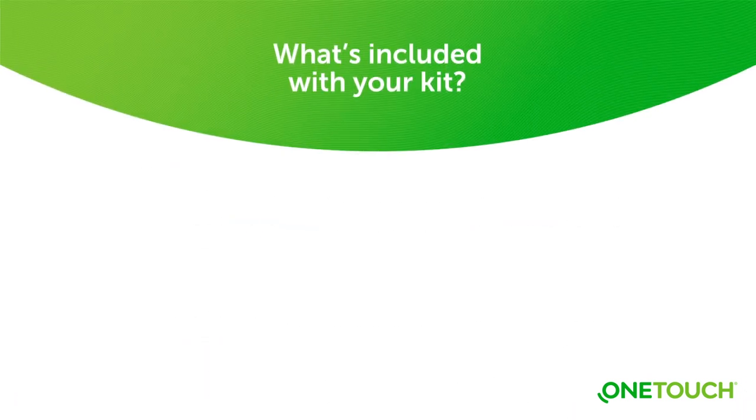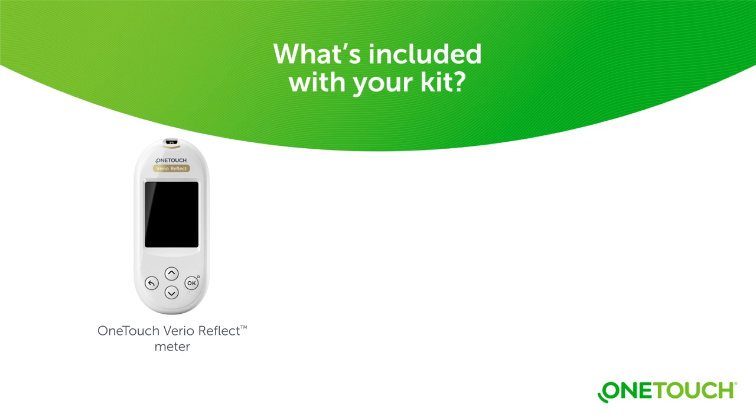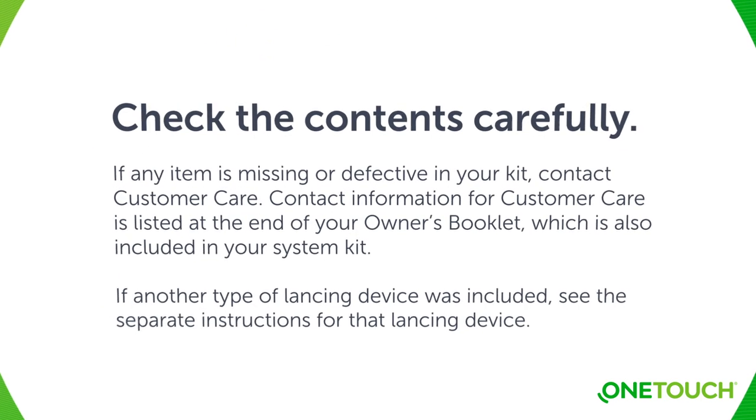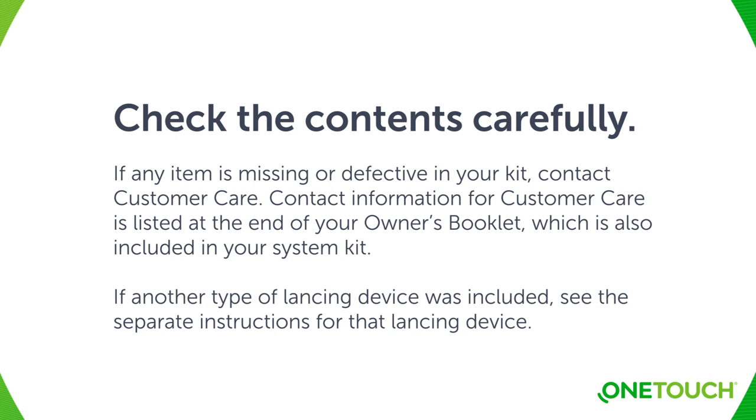In your OneTouch VarioReflect system kit, there is the meter itself, the OneTouch Delica Plus lancing device, and a pack of OneTouch Delica Plus lancets. The OneTouch VarioReflect meter uses OneTouch Vario test strips, which can be purchased separately. Check the contents carefully. If any item is missing or defective in your kit, contact customer care. Contact information for customer care is listed at the end of your owner's booklet.